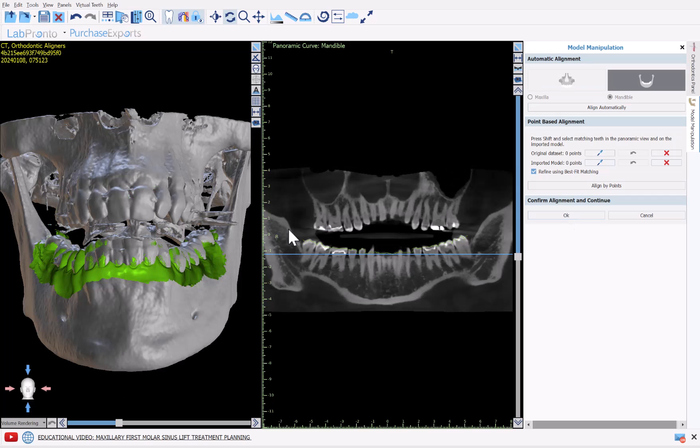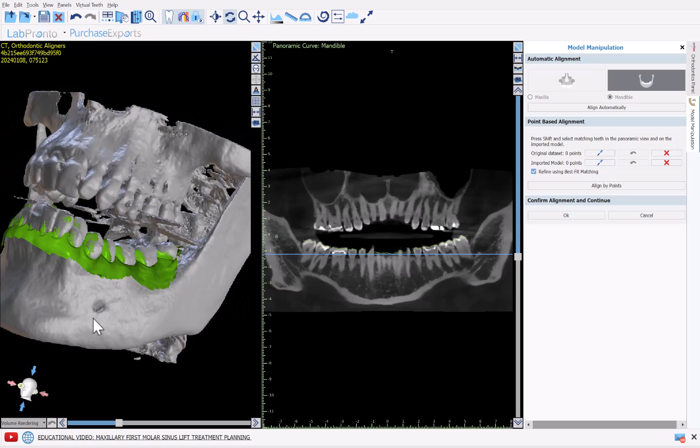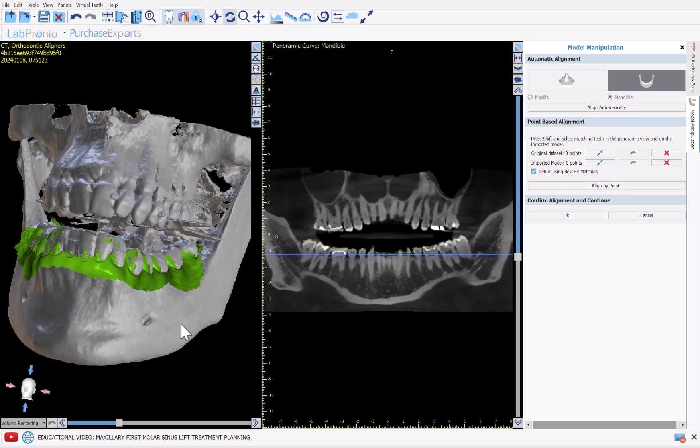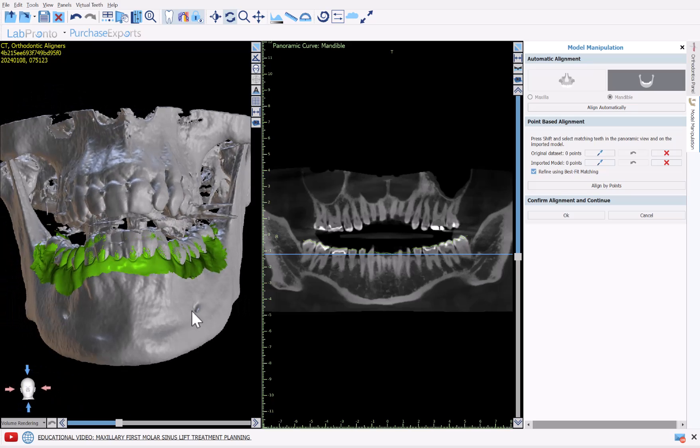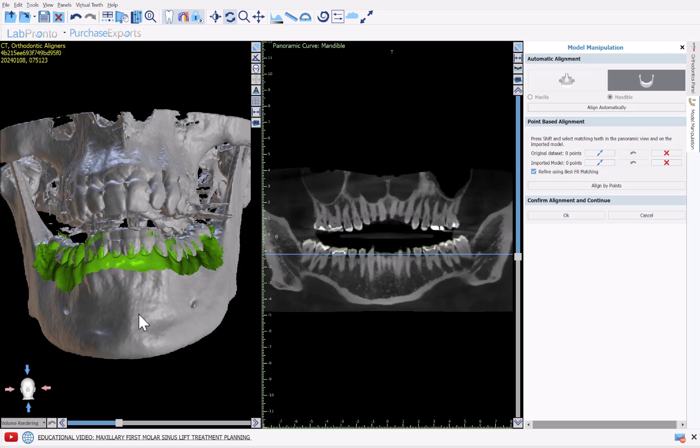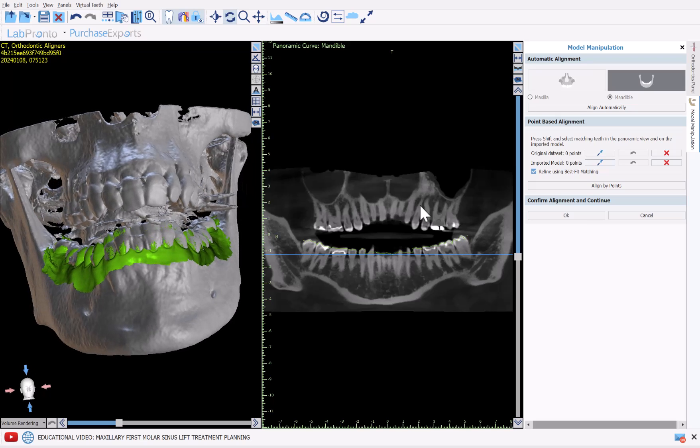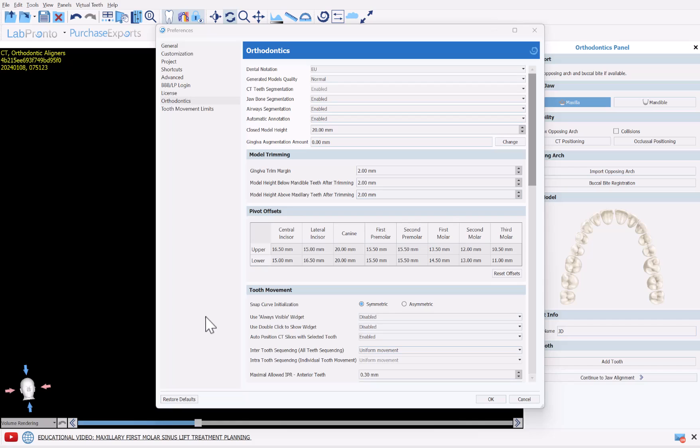I'm going to click OK to confirm alignment and continue. We can now see the alignment for the mandible as well, both in the 2D view and in the 3D view. You're able to grab and drag and rotate with your left mouse button, zoom in and out with your right mouse button. And I'm going to click OK to confirm the alignment and continue.